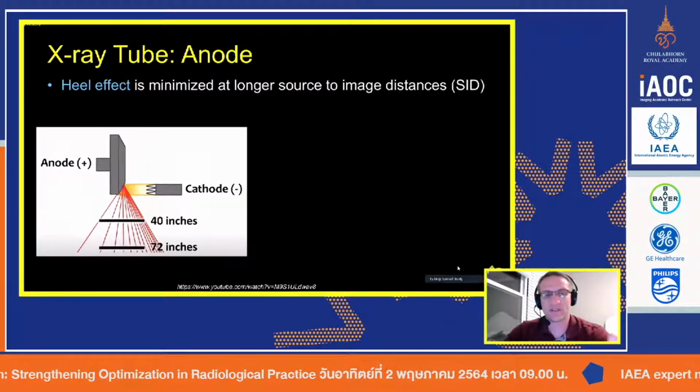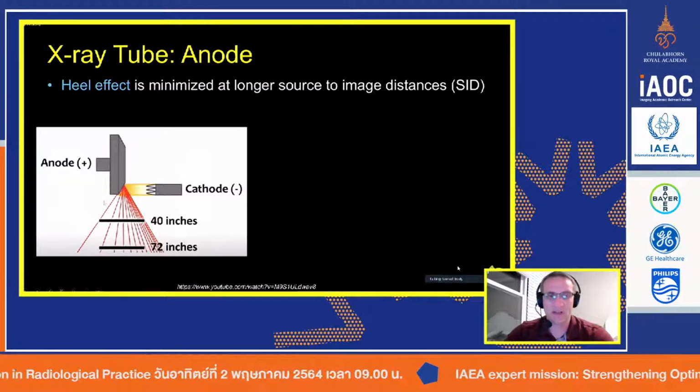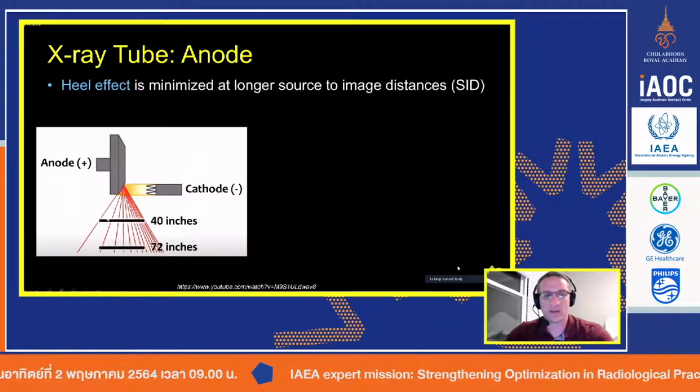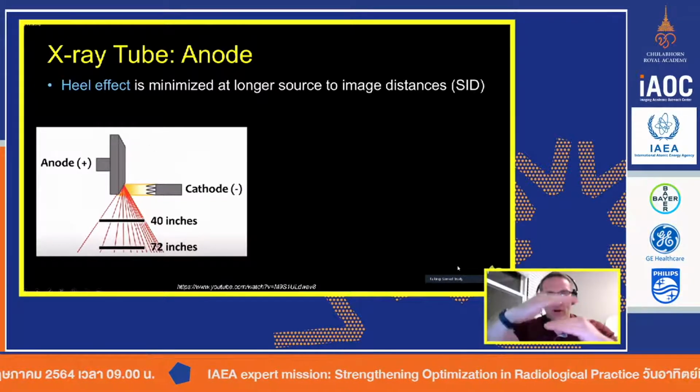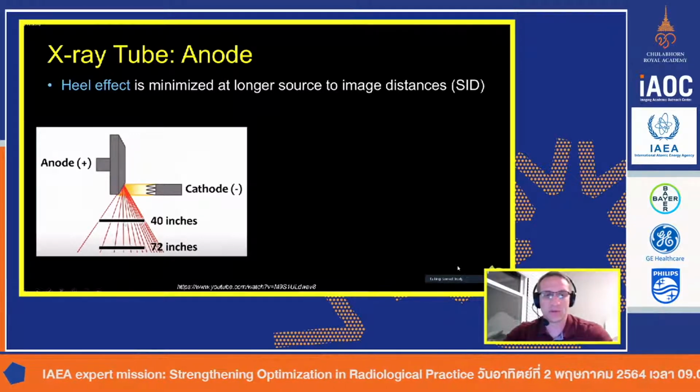We can use this understanding when we set up our distance and our size of field of view. So for the first thing, obviously, the closer we are to the detector, so let's say we're doing a normal tabletop application.